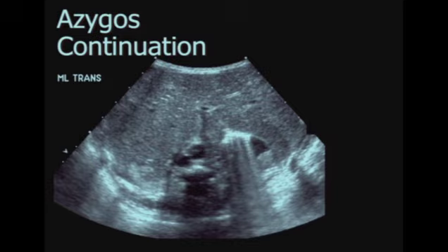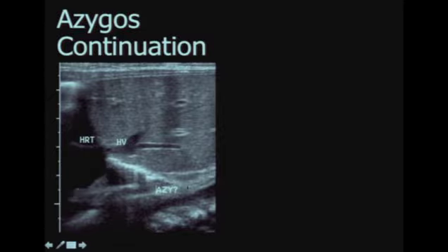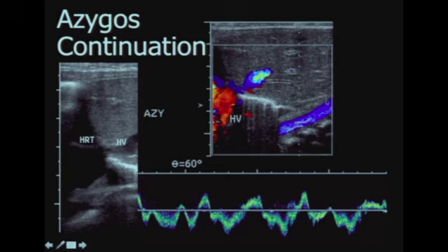Occasionally, ultrasound can be helpful in figuring out azygous continuation. This is a child that had some difficulty getting vascular access from below. You can see the aorta. We don't have a normal IVC, but we do have a very large azygous, which you can follow up on multiple projections. Here you can see we did not have a normal IVC, we had normal hepatic veins. Sonographer wondering if this is a large azygous vein, and turning on color Doppler and actually measuring it, you can see, yes, in fact, that's what that was.